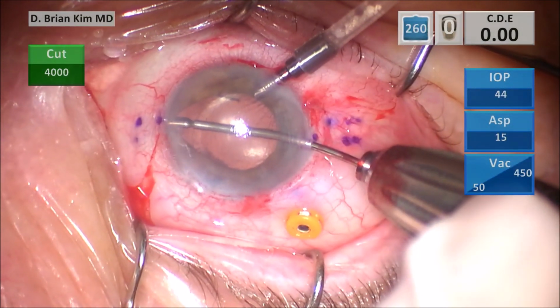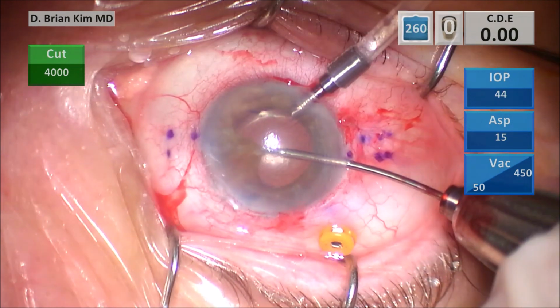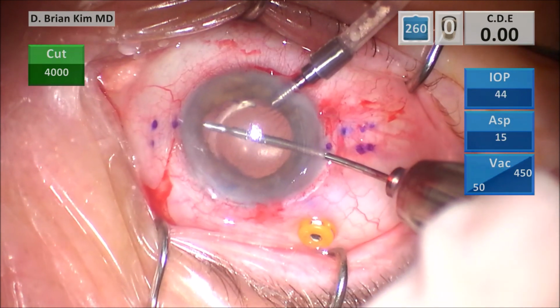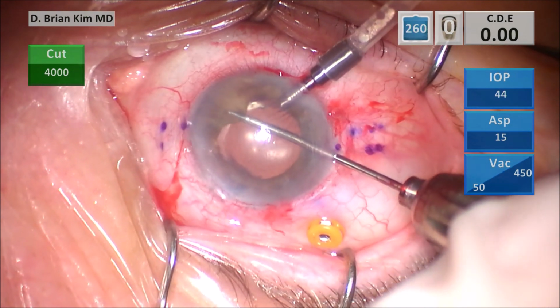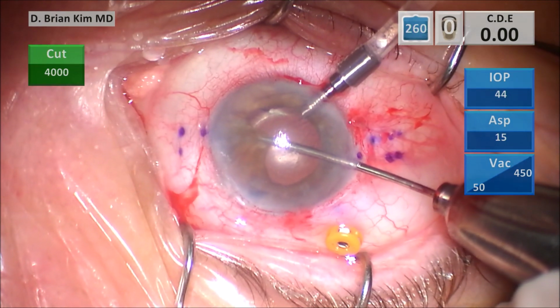I'm just assessing to see if I'm able to do the pupilloplasty, and I'm just grabbing that peripheral iris. What has happened is the feet of the ACIOL haptics really caused a lot of fibrosis to the peripheral iris in that area. And so I'm going to do a pupilloplasty the best I can.